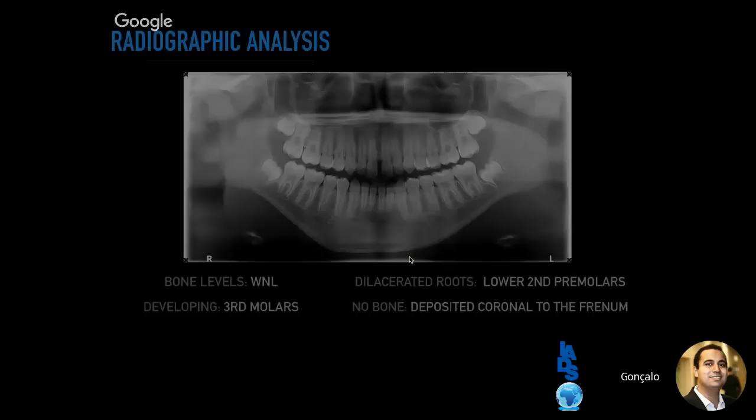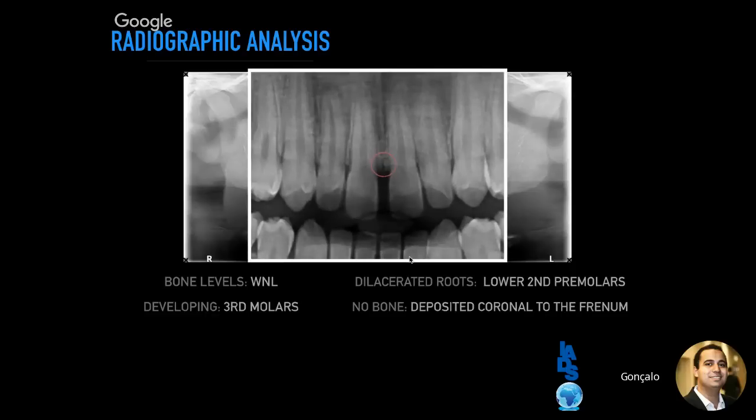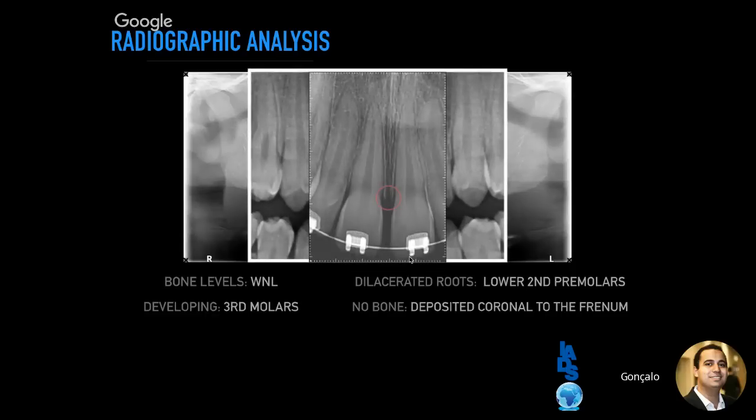You can also see radiographically the V-shaped bone cleft that we are able to see in these cases, and also in the periapical, you can see at the crest that V-shaped bone cleft, typical in these cases of hypertrophic frenum.